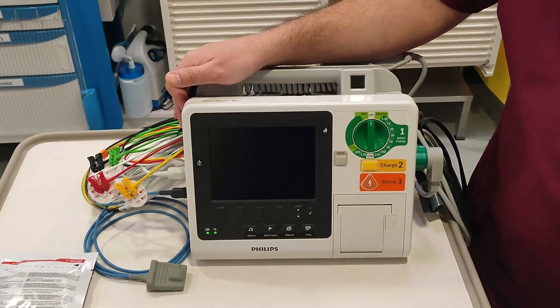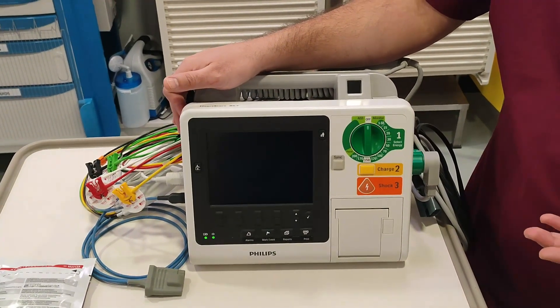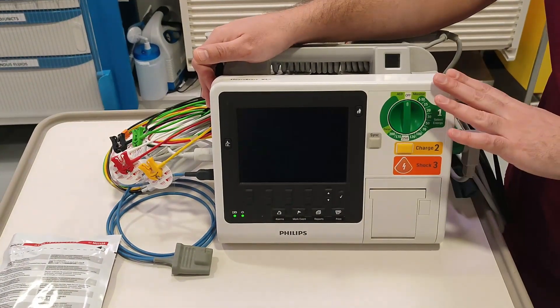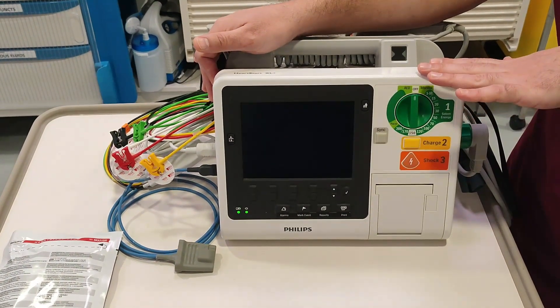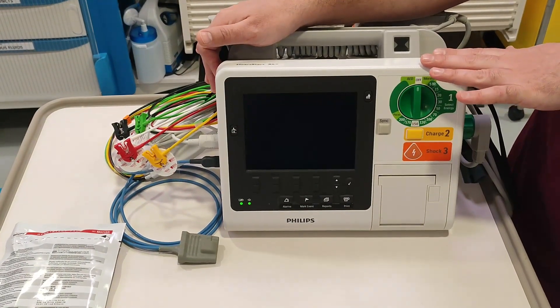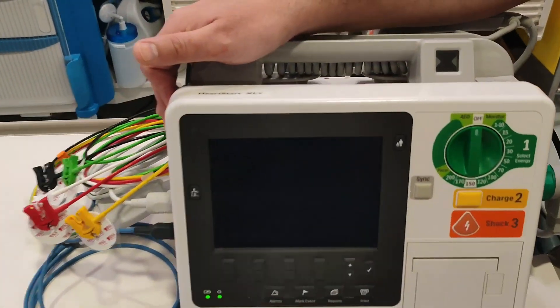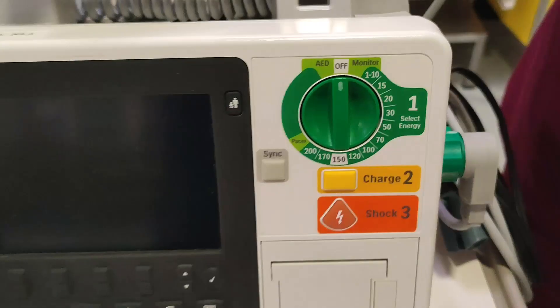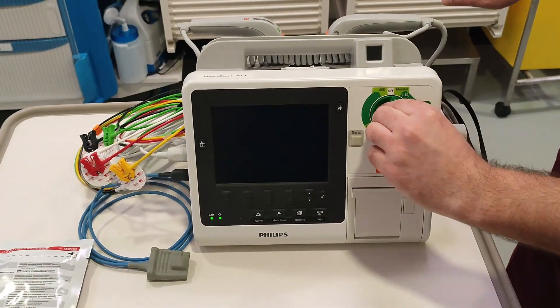In this video I will explain how this defibrillator is used for different kinds of shock. We have multiple types of shock: cardioversion shock, defibrillation, and synchronized shock. Another feature of this defibrillator is that we can use it for pacing purposes as well. I will show you how to get it ready and how to set the modes.